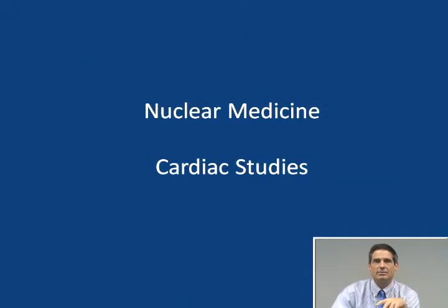Now, I'm going to talk here about the cardiac studies. The imaging component of these exams is usually added. Well, some people just routinely add it every time they do a stress EKG. Other people add it when the baseline EKG has abnormalities, making interpretation of the stress-induced changes problematic, or when the patient's on digitalis, or when there's been previous revascularization, or when your stress EKG done without imaging was equivocal.